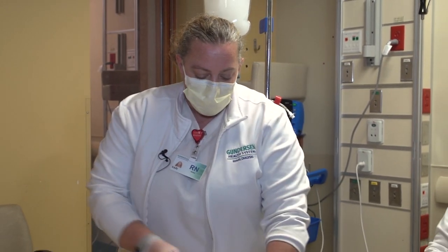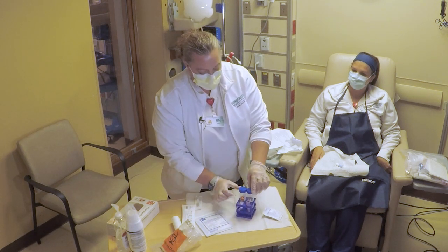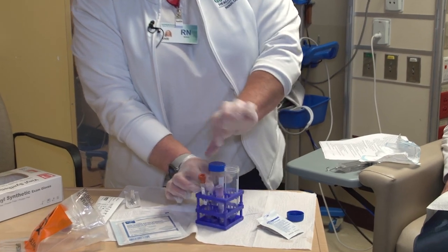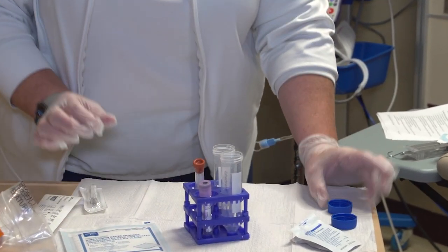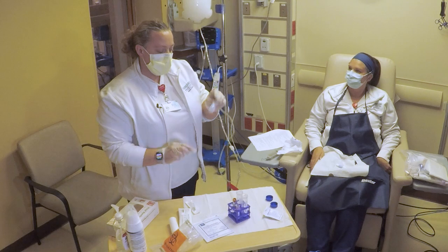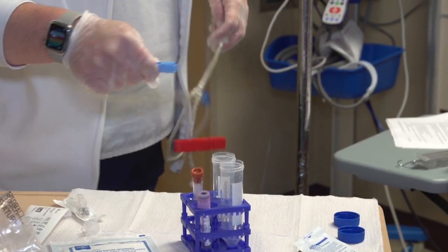For your cell count and your cultures, you'll need 2 Falcon tubes, a red top, and a purple top. You want to keep your Falcon tubes as sterile as possible. You remove your caps aseptically, set them down, and you'll use the other line from your manual drain bag, keeping that clean.